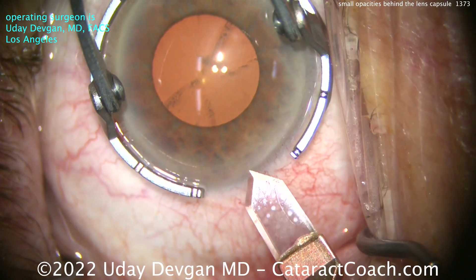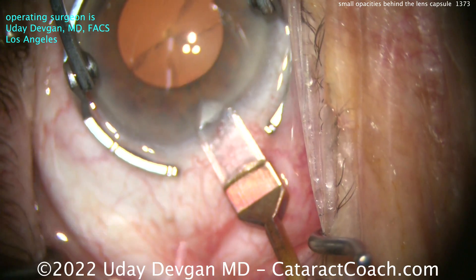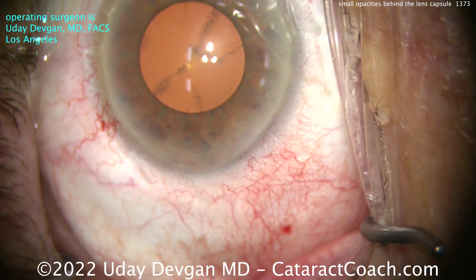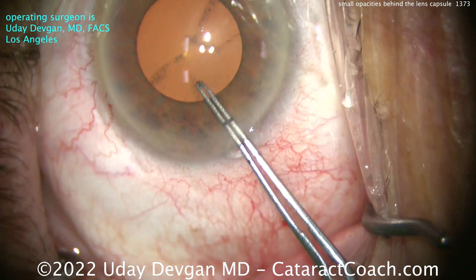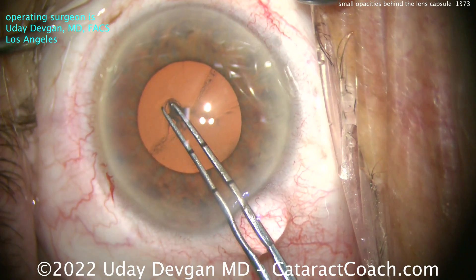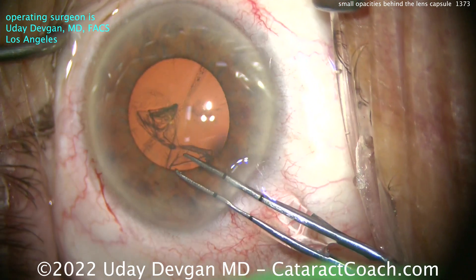Putting the fixation ring down and using a diamond keratome, let's make that main incision. That looks pretty reasonable — let me get a little bit better approach. I like the incision. Let's get that eye centered up again and get a rhexis going here. We're going to make the rhexis right up against the pupil margin. The pupil is just slightly above 5 millimeters — I measured with my forceps — so I'm going to make this rhexis right about at the pupil margin. That should give us a slightly larger than 5 millimeter capsular rhexis.